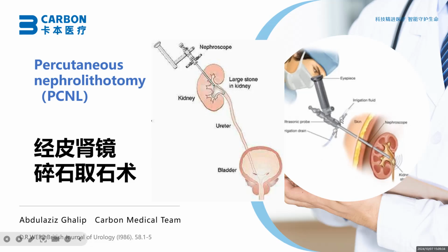From this picture we can see the doctor can, from this artificial channel, see the inside of the kidney, so do some other operation.